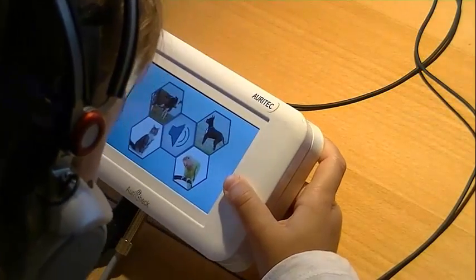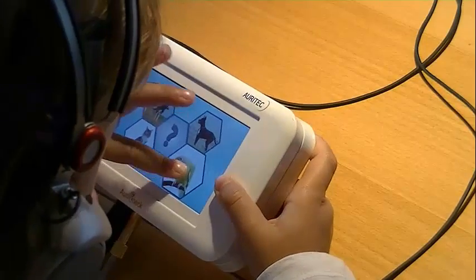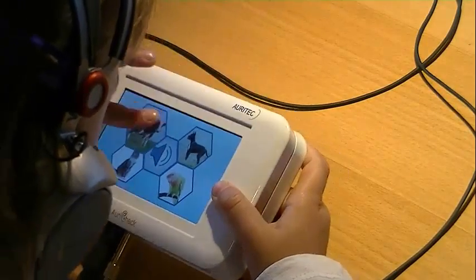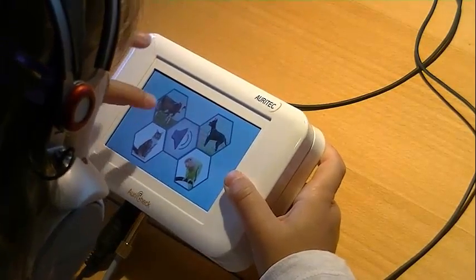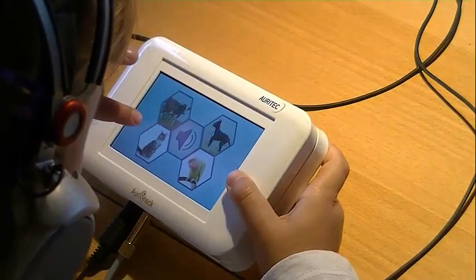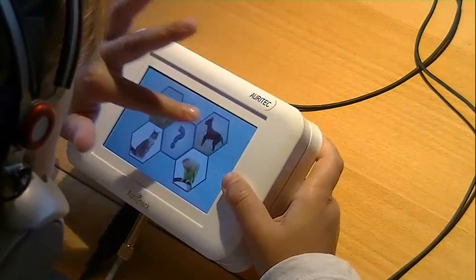All animal voices will be played with 70 dB SPL once in a fixed order: cow, dog, cat and bird. Afterwards, the randomized procedure of presentation begins and the signal level for the corresponding animal sound will be automatically reduced after correct identification.